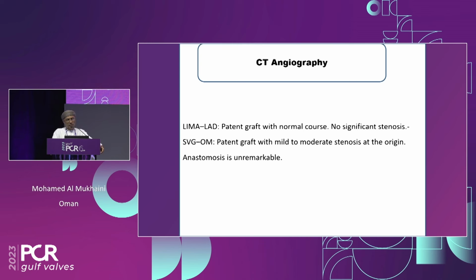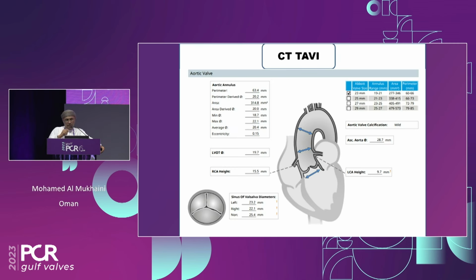CT angio was done to evaluate the grafts. The LIMA to the LAD was patent, and the SVG to the obtuse marginal is patent with mild to moderate stenosis at the origin. And this is the CT TAVI.